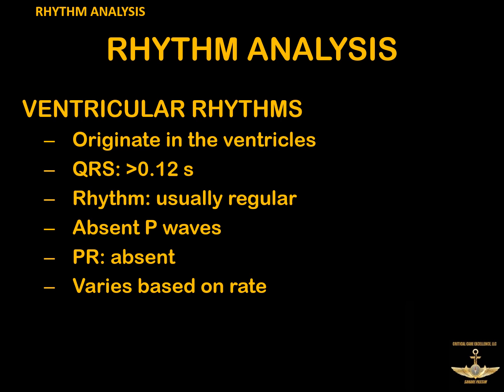Well, when you hear the term prolonged depolarization, then what you should be thinking of is wide QRS complex, because the longer the depolarization takes, the longer it's going to take for that impulse to move throughout the ventricles and cause the whole thing to contract. The longer that takes, the wider the QRS complex gets. So that's going to be your hallmark for your ventricular rhythms.